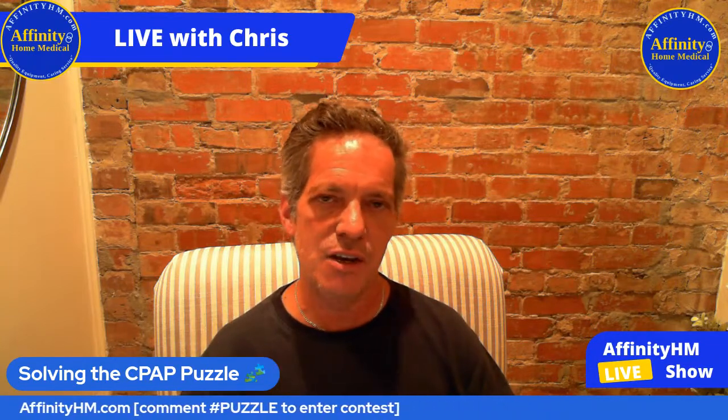Matter of fact, a lot of people go without water and use CPAP without water. I'm not necessarily recommending that because most people do better with some humidity. But some people do go without water, or you can put the water in it and just turn off your heated humidifier. You're going to get a little bit of humidity, but I do recommend playing around with it. When you wake up in the morning, if you're feeling dry, then increase the humidity. But if you're not feeling dry or rough in any sort of way, then go that route. Absolutely.